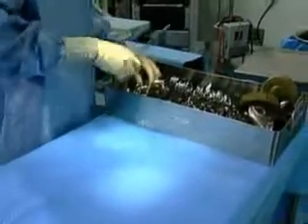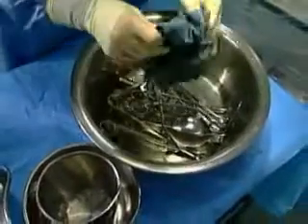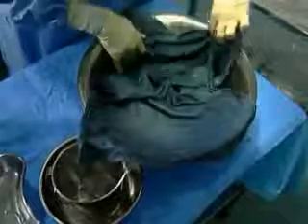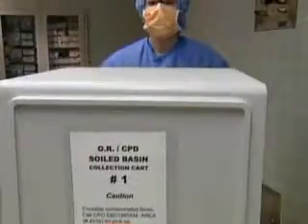Instruments may be placed in a specially designed container for pre-soaking instruments. This container is filled with water and covered with a water-moistened towel. It is then placed in a plastic bag. Instruments may also be placed in a closed or covered cart for transport to the decontamination area.